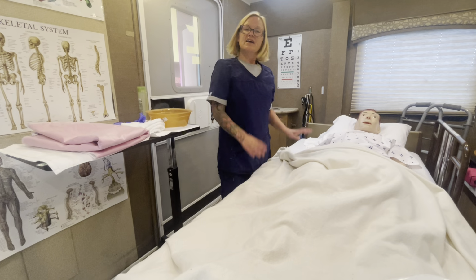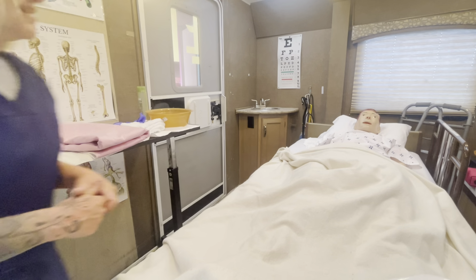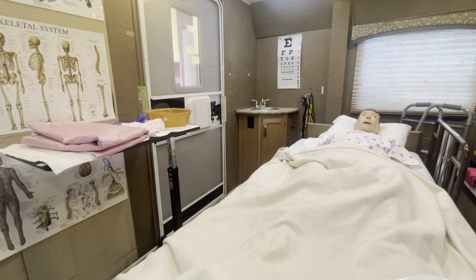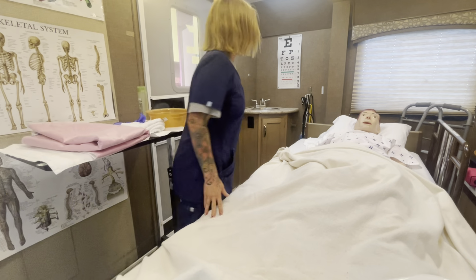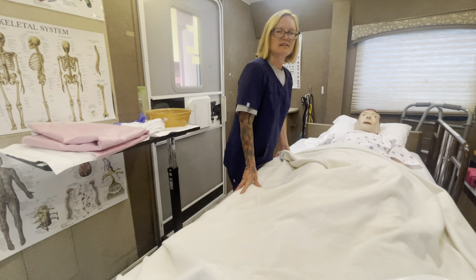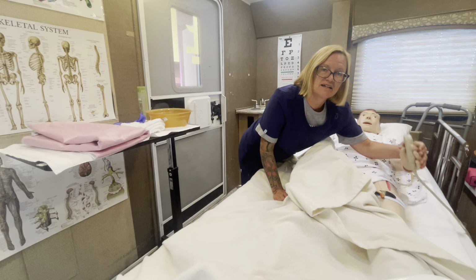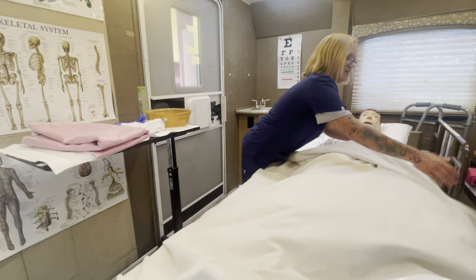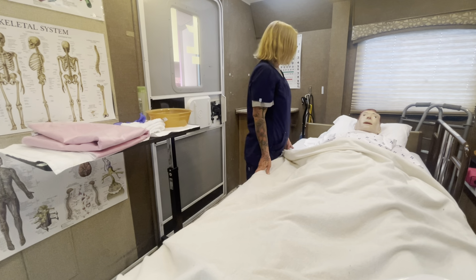All right, so then for our skill, the first thing we're going to do is knock on the door. I'm going to wash my hands. I'm going to provide privacy. I'm going to check the bed to make sure that it's in a locked position. I want to make sure that my patient has his call light, which he does in his hand. And then I'm going to introduce myself. Hi, my name is Sherry. I'll be your CNA today.